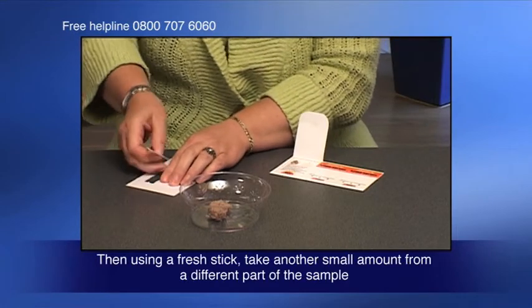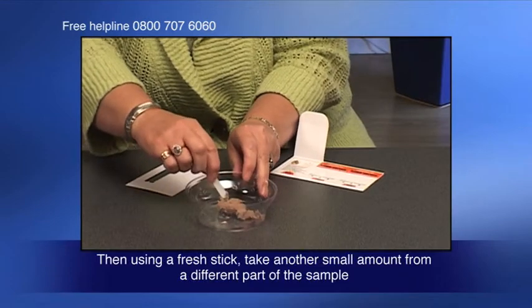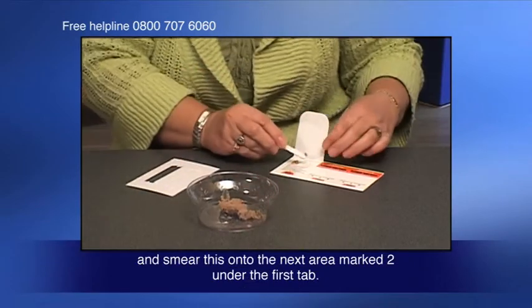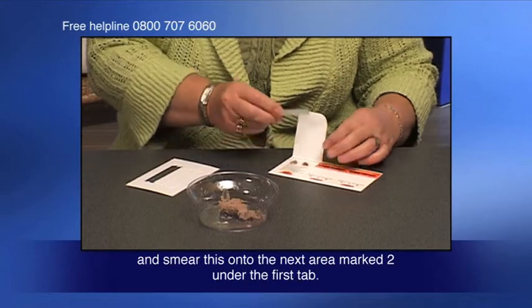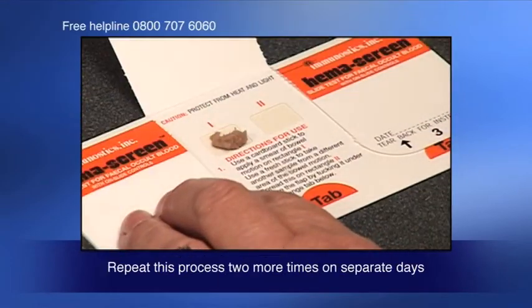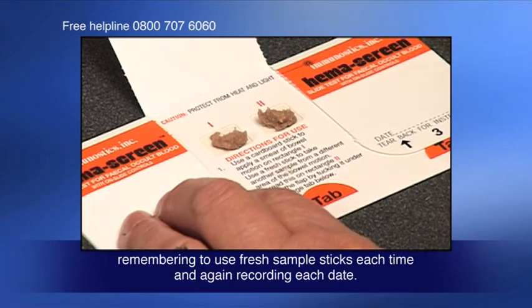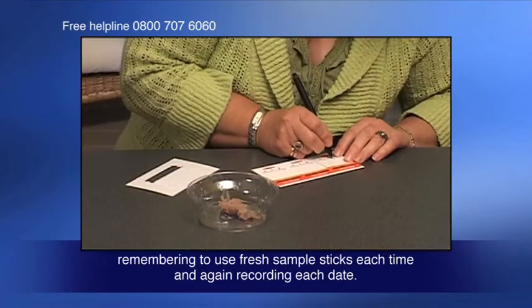Then, using a fresh stick, take another small amount from a different part of the sample and smear this onto the next area marked two under the first tab. Repeat this process two more times on separate days, remembering to use fresh sample sticks each time and again recording each date.